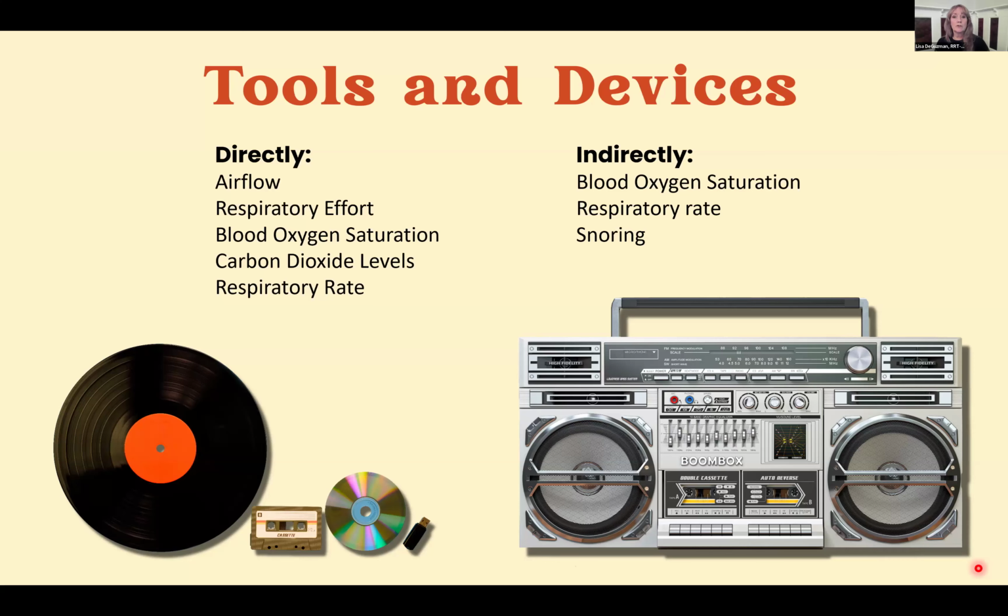And then snoring. Snoring, loud snoring or no snoring on a snoring patient can tell us there's a severe problem going on, or they're snoring that is just benign. And we have patients who snore and their oxygen's good, CO2 is good, and their airways are good. They don't have many, if any, respiratory events. So when you fully obstruct, you're snoring, snoring, snoring up to it, fully obstruct, and now there's no more snoring. So if your snoring goes away on a patient with obstructive apnea, that may be the pinnacle or the worst part of the obstruction. So high and low can be a problem.